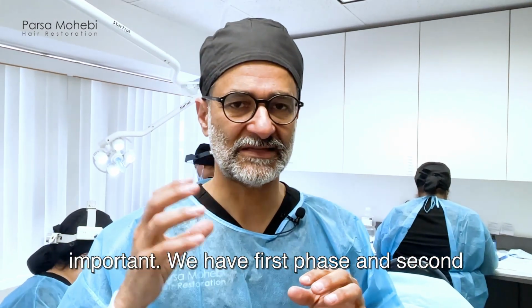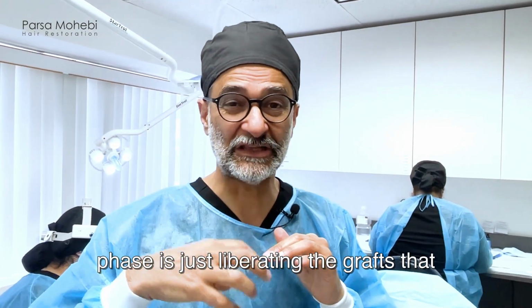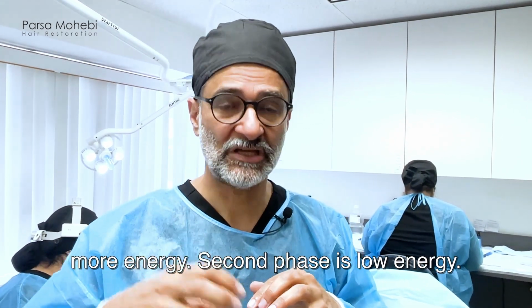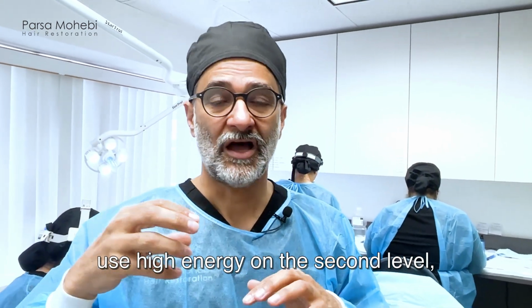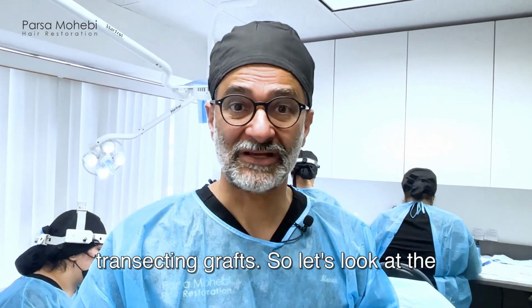We have first phase and second phase. The first phase cuts through the tough portion of the skin. The second phase is just liberating the grafts that are ready to come out. First phase is more energy, second phase is low energy. If you use low energy on the first phase, we cannot cut through the skin. If you use high energy on the second level, we're increasing the chance of transecting grafts.